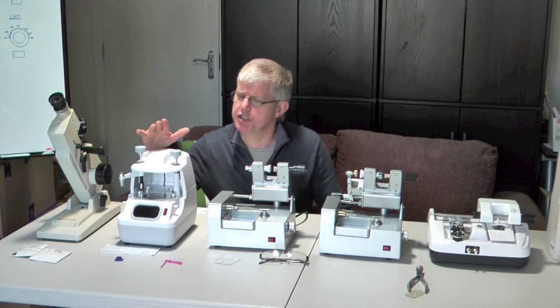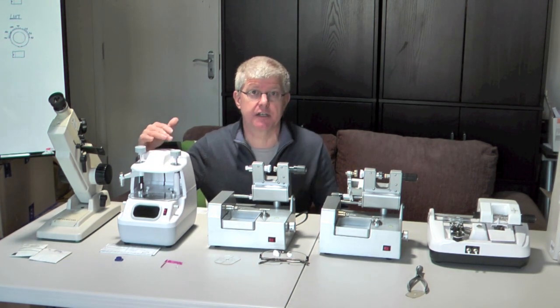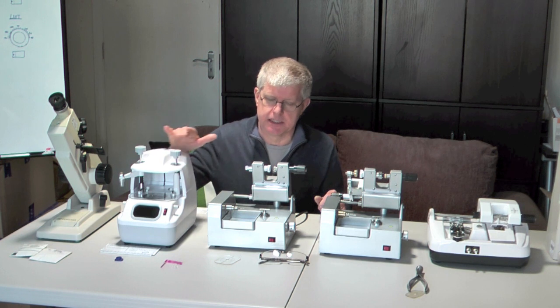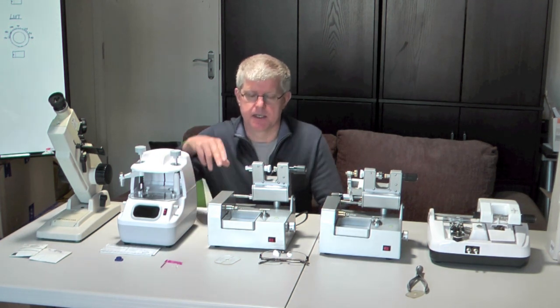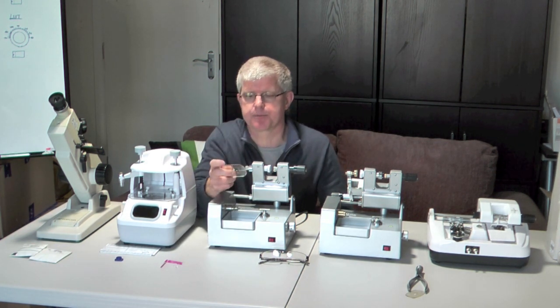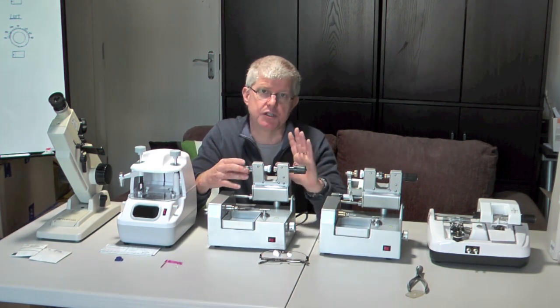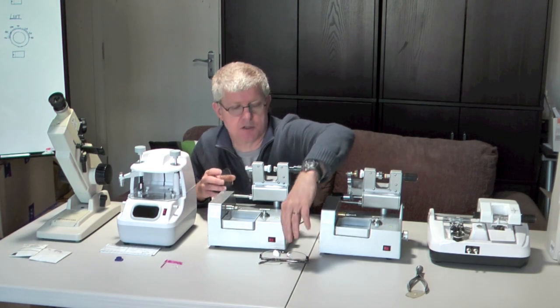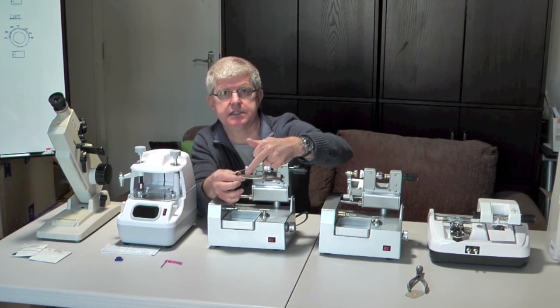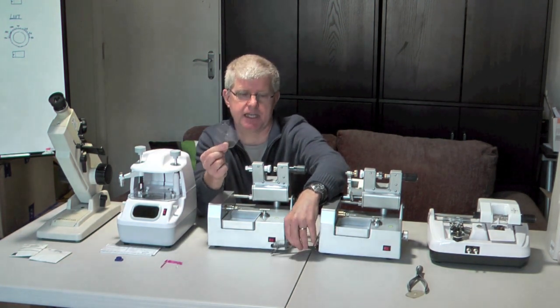This is a lens blocker, which you can manage without, but they are very useful because it enables you to be a lot more accurate and quicker in blocking the lenses. This is a pattern maker, and this creates a pattern or shape that corresponds to the frame we will be glazing. It uses a little plate like this. We do use second-hand glasses — we recycle old glasses. We'll take the lens out of the frame, block it up, put the lens in here, and this machine will cut the plate to match the shape.